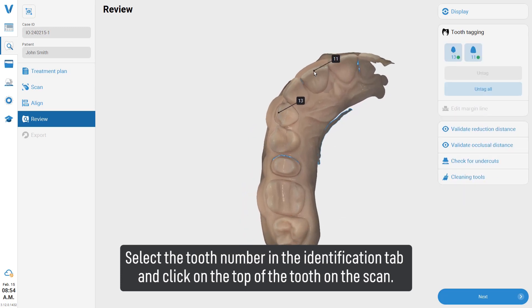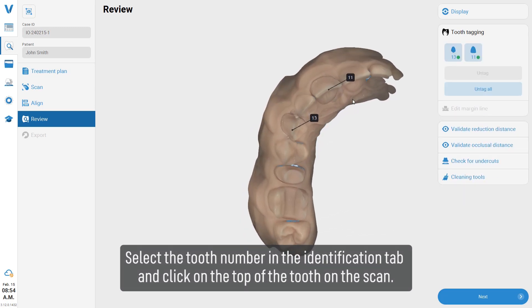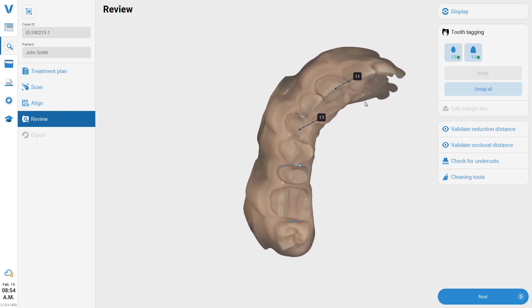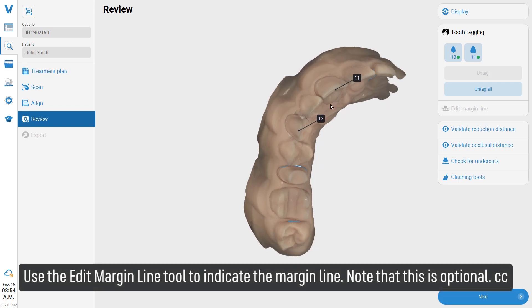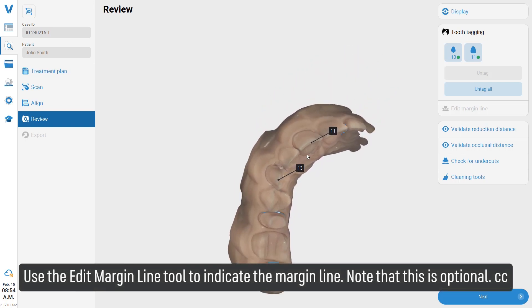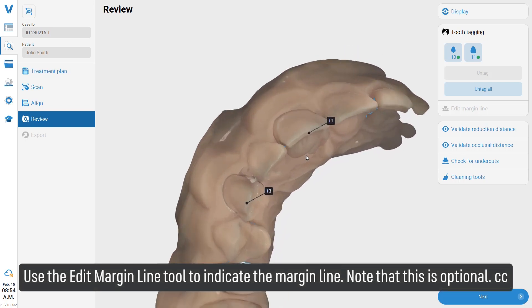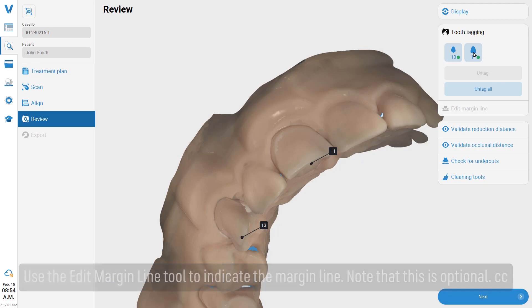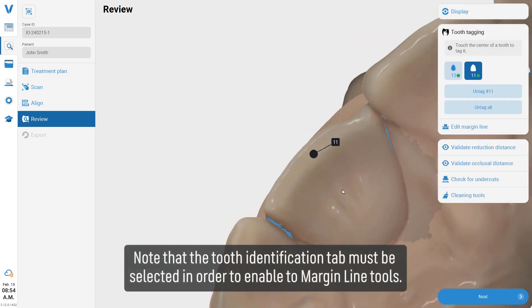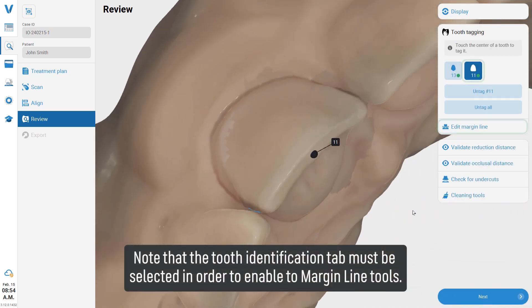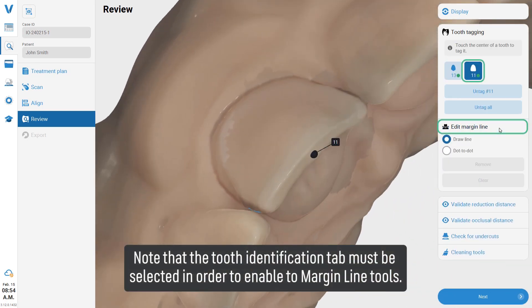Click on the top of the tooth on the scan. Use the edit margin line tool to indicate the margin line. Note that this is optional, and that the tooth identification tab must be selected in order to enable the margin line tools.